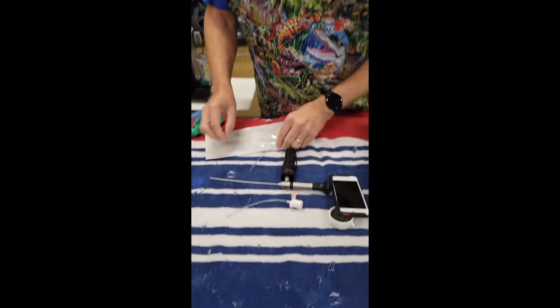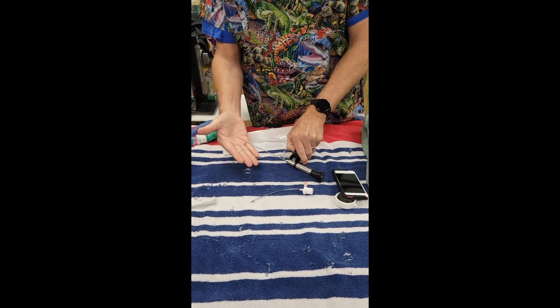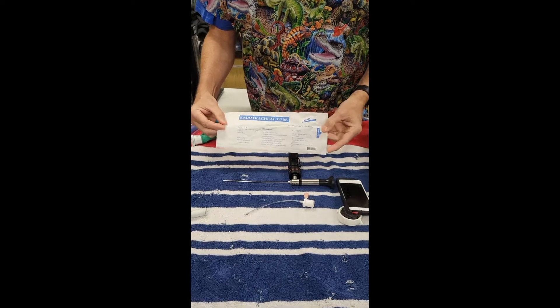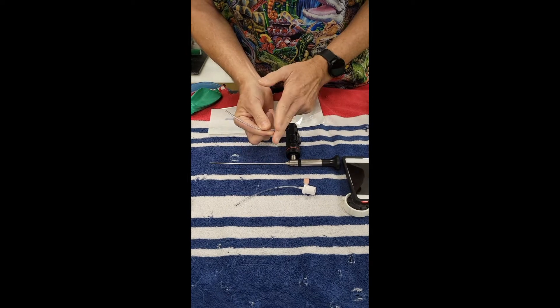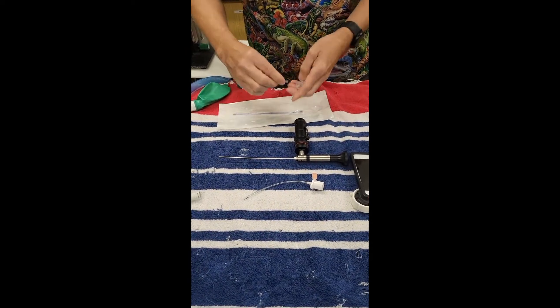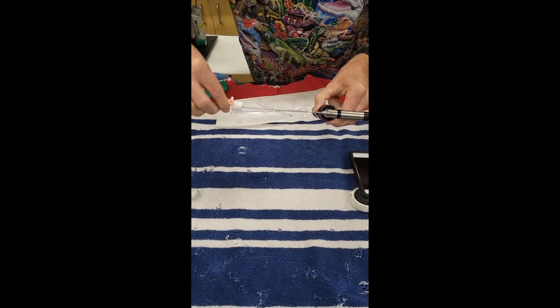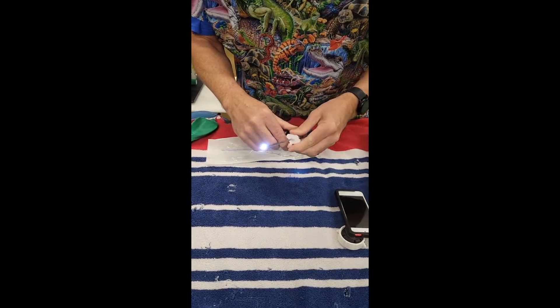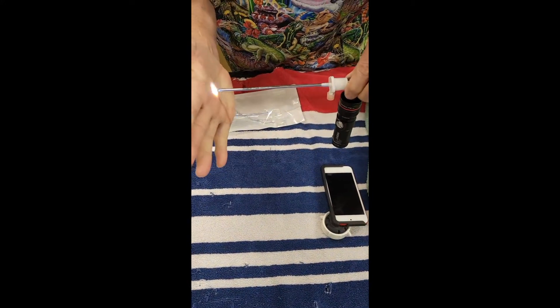We're going to be using an over-the-endoscope technique where we take a store-bought endotracheal tube. To make it the right length, we cut off one end — we cut it off to make it the right length. The right length is when it fits on the scope and we are even with the end of the tube right there.